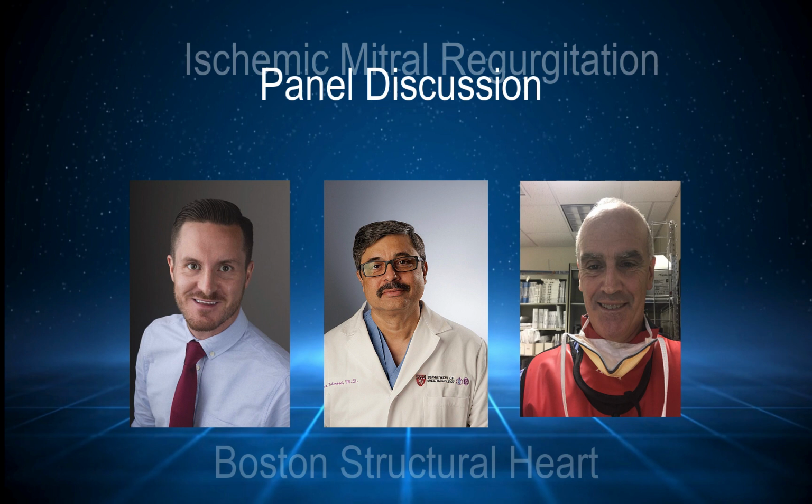Right question, but I think the gentleman who actually brought up this whole concept is sitting right next to me. I'll punt this question to Dr. Maslow. Yeah, so there's a dilemma there. Let's just say the normal coaptation length, or the zone of coaptation, ideally is at least 5 millimeters. Even more, right? I think in the early literature, it was quoted about 8 millimeters, and since then we're down to 4 or 5 millimeters. And if you've got leaflets that are only coapting by 1 millimeter, then you really have no reserve whatsoever. So at that point, you make the decision of what you think the ventricle is going to look like.